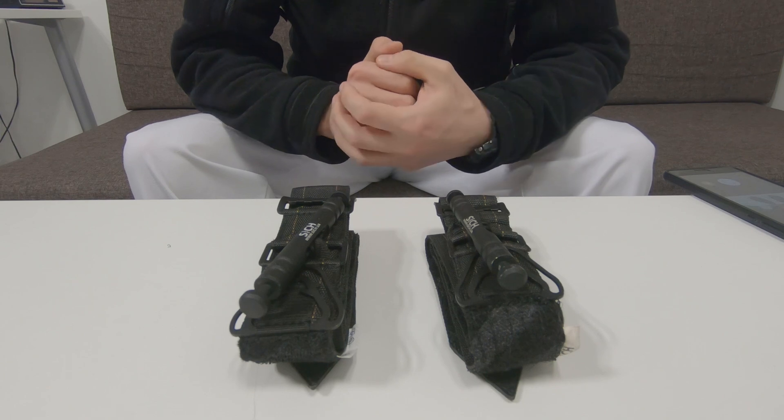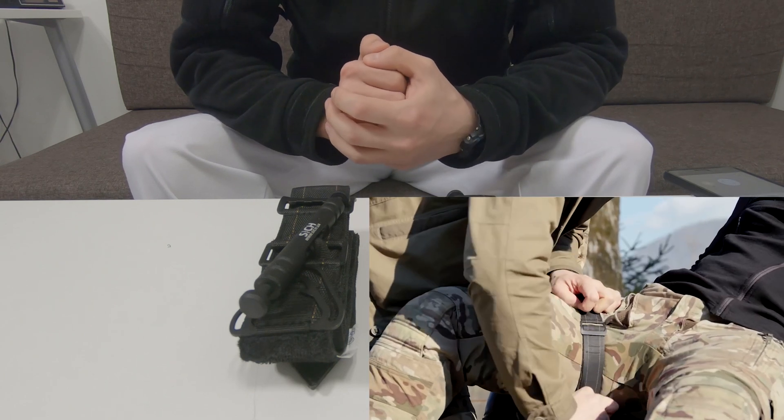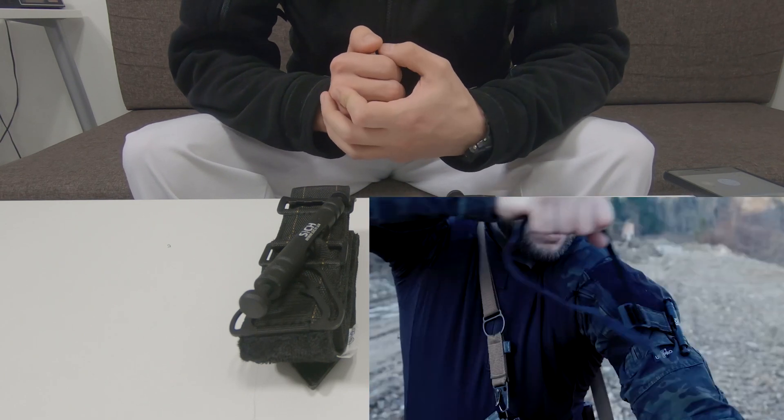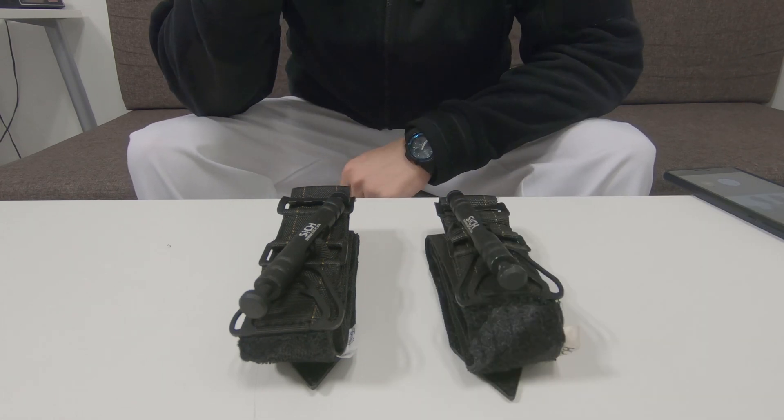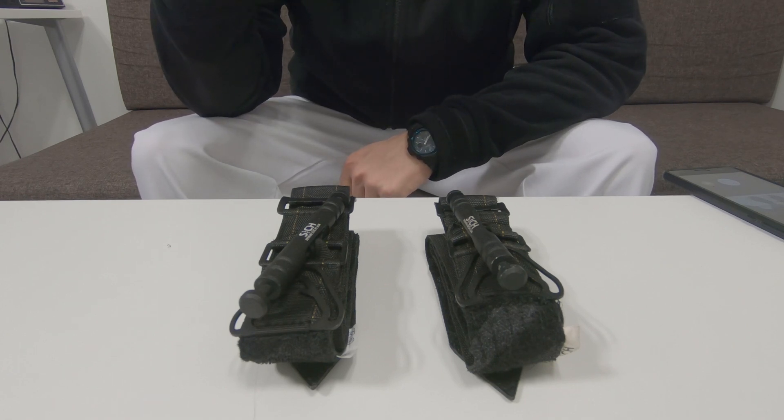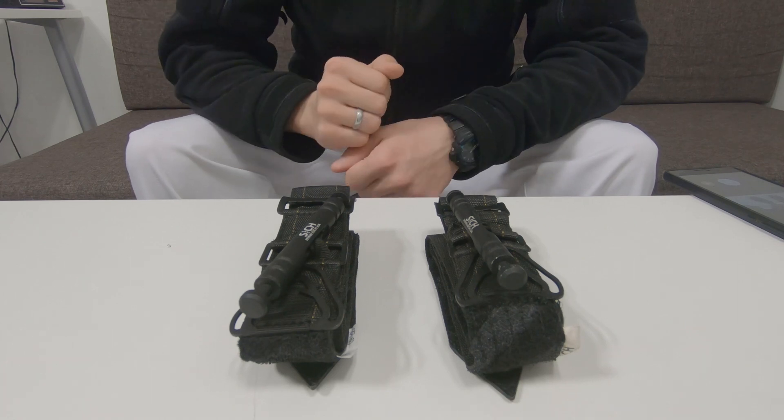As an ultimate test, it was wrapped around Giga's thick thigh and masculine biceps. My goal for today is to prove that it will still work. We will now move to a medical facility here in Czech Republic to test it with a professional ultrasound machine in real time and to see how it performs.